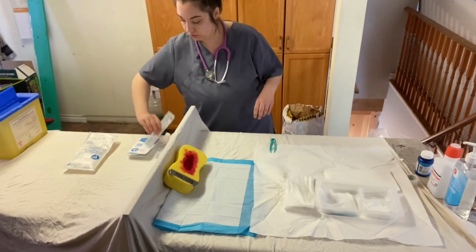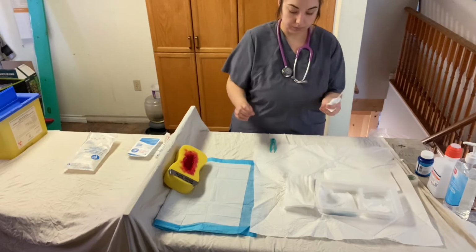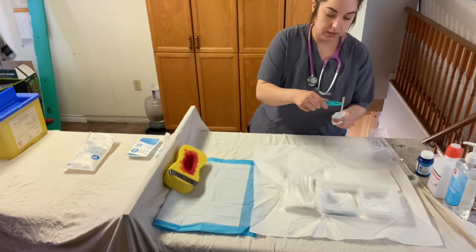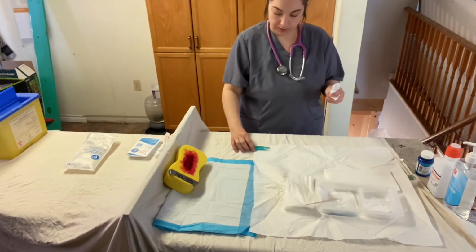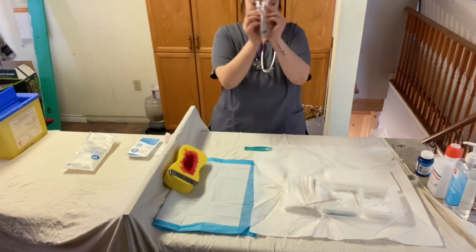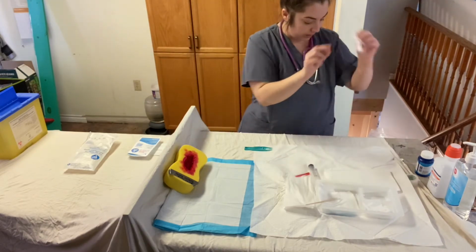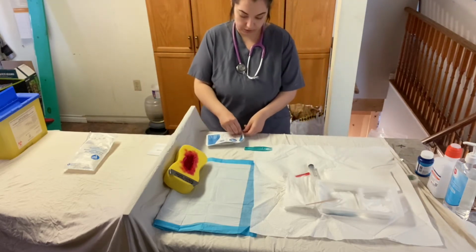Then I'm going to be using some cotton tip applicators. I'm going to then use my forceps just to place these into my sterile field again, just because I don't want them to fall. So placing that in my 1-inch border, this in the garbage. I'm going to then place in a syringe and a blunt tip needle for my syringe. This is for irrigation. Then I'm going to grab from my suture kit.